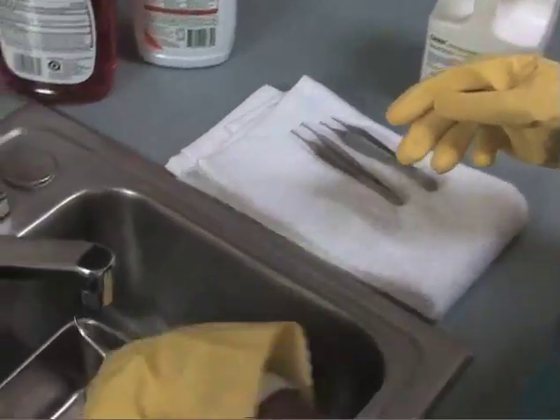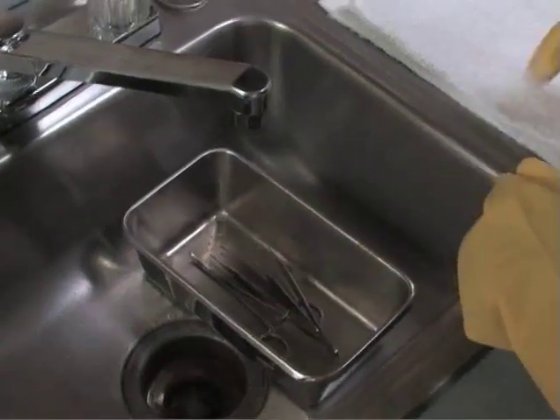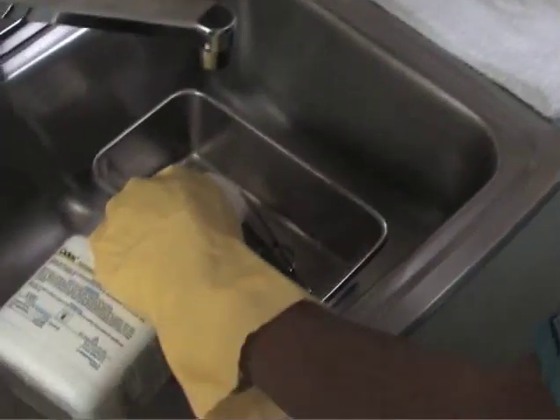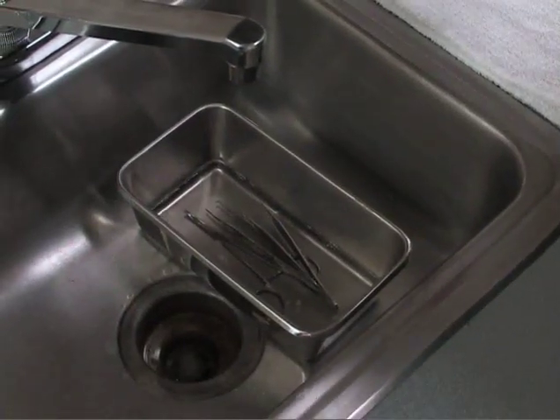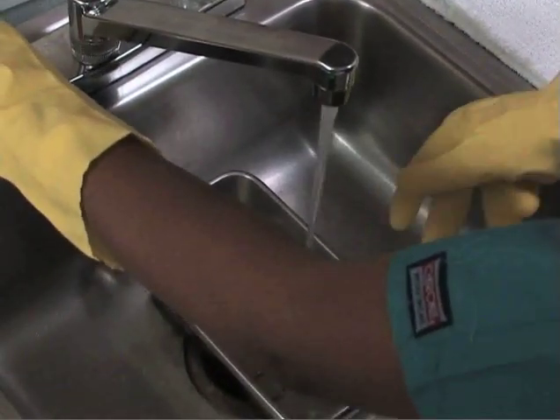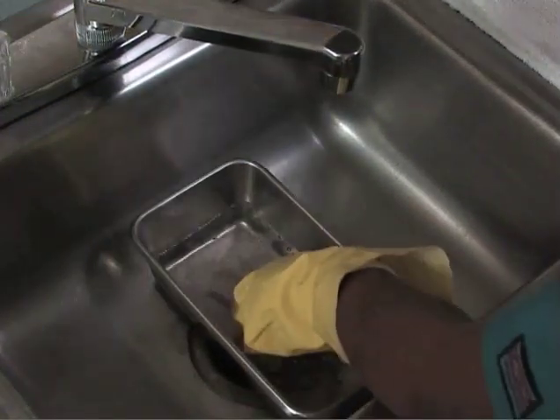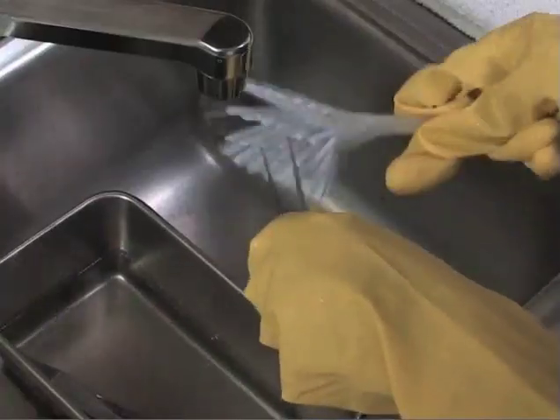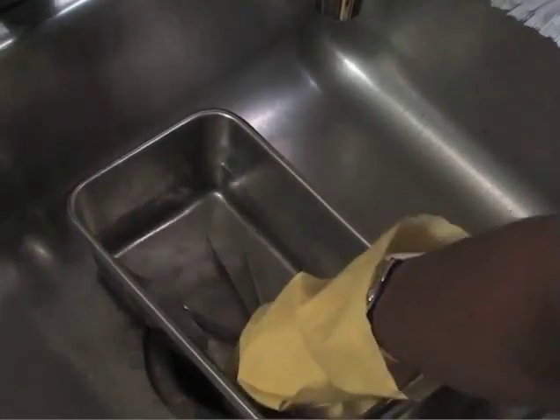Place the instruments back in the basin and add the recommended amount of cleaning agent and water if necessary. Working with one instrument at a time, use the scrubbing brush to clean all edges, grooves, and open hinges. Rinse the instruments one at a time with hot water, then dry with a paper towel.